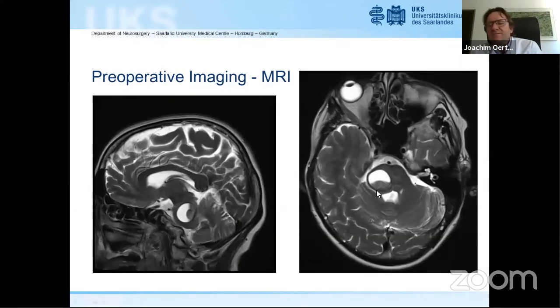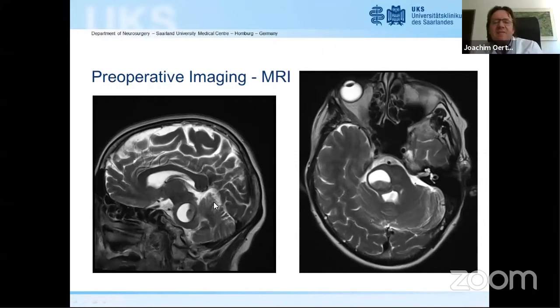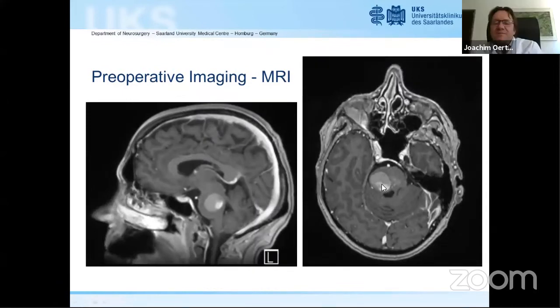There's no edema. There's absolutely no edema. You see that? That's right. Yes. So, but it's like hemangioblastoma. I think it's a good differential diagnosis. Right. So one more. What is another option?